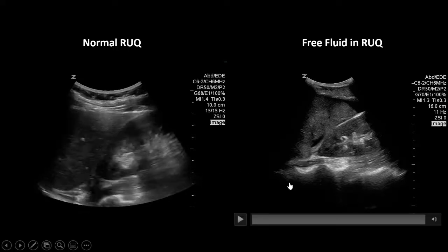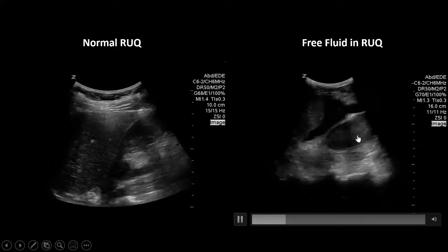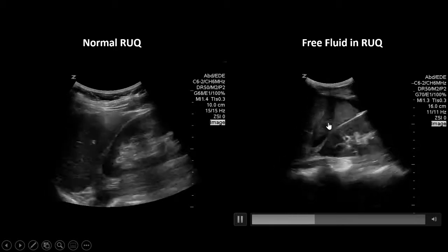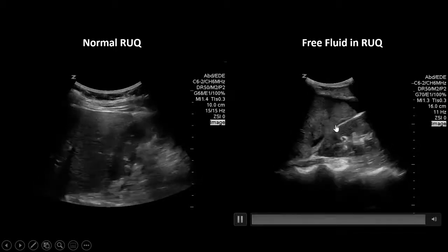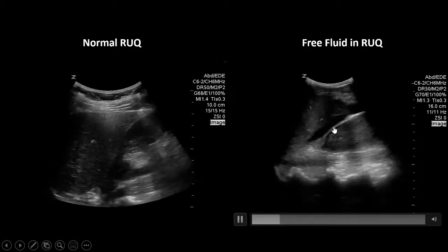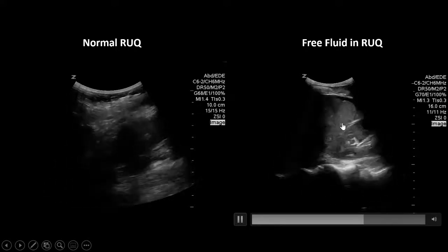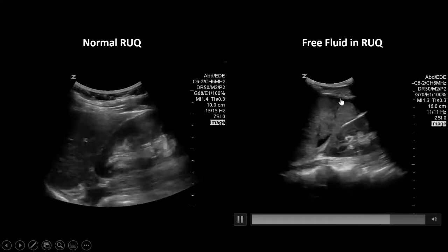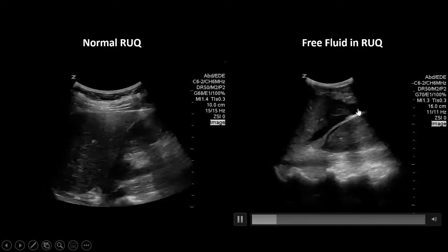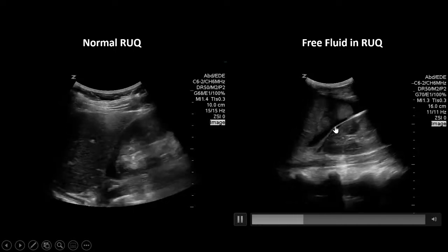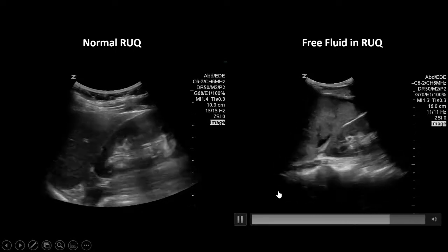Now let's look at this scan. We have our kidney and our liver here, and you can clearly see there is black in between the interface between the kidney and the liver, with some also around the caudal tip of the liver as well. This is what a positive right upper quadrant looks like.